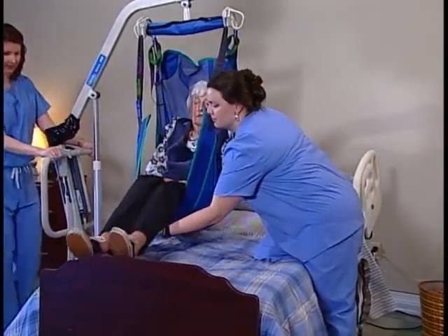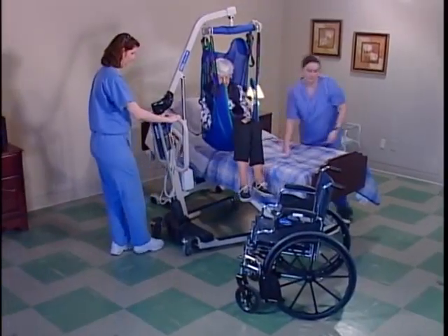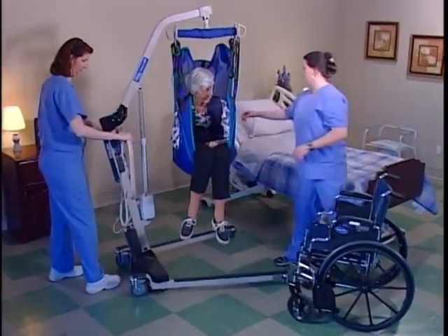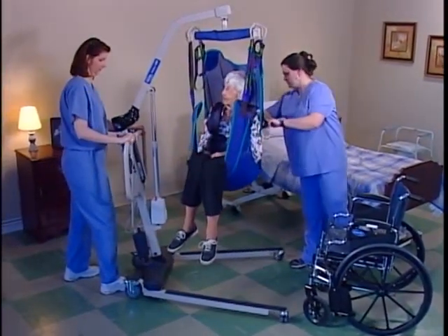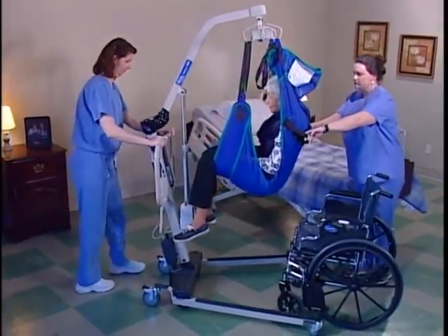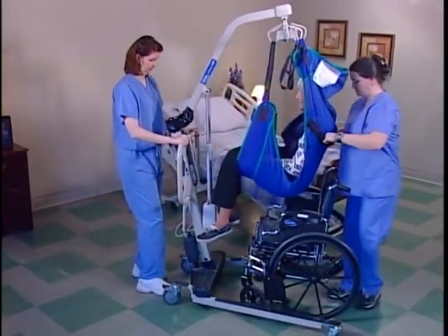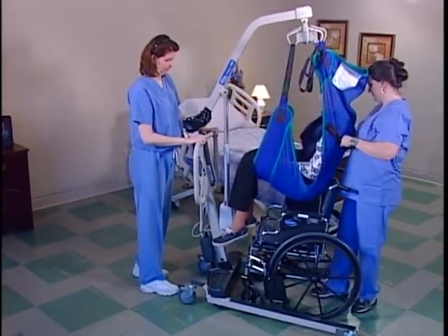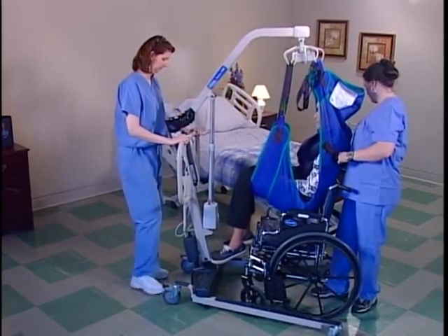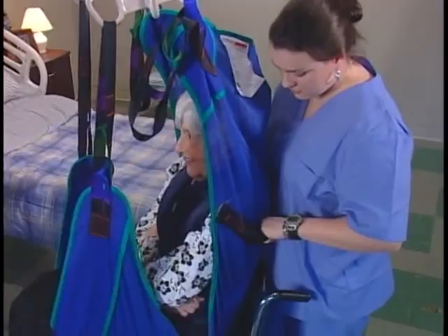Fold the sling lengthwise. Position it so the seams are facing the edge of the bed and the folds are facing the resident. The top edge should be slightly above the resident's head and the bottom edge should be just above the knees. A quick way of telling the top from the bottom is by locating the identification labels — they are sewn at the top of the sling.